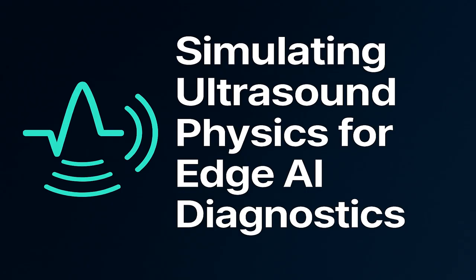Okay, so let's put this into practice. Let's trace the echo from a single tiny scatterer in the tissue. How do these frequency domain components combine to model the signal that's received by the transducer? So we model the total frequency response from a single scatterer, let's call it H_s(f), as the product of 3 primary elements. First, you have the spectrum of the transmitted waveform itself, T(f). So that's the shape and bandwidth of the pulse we send out. Yep.